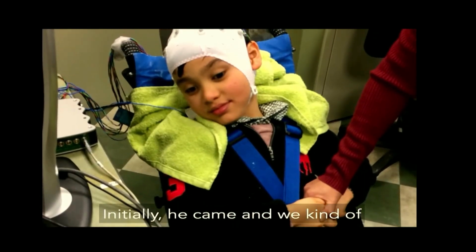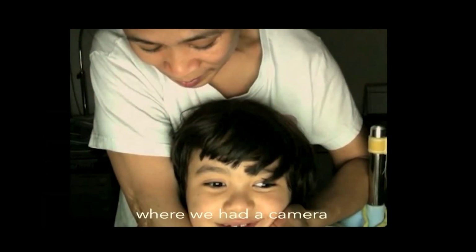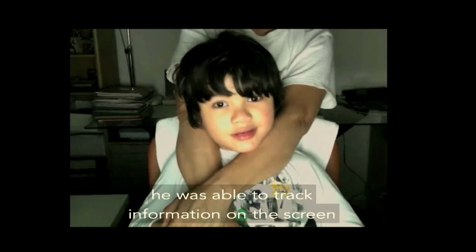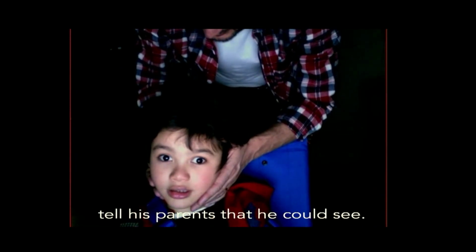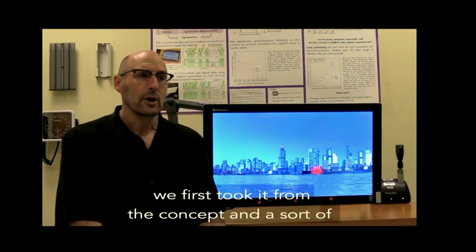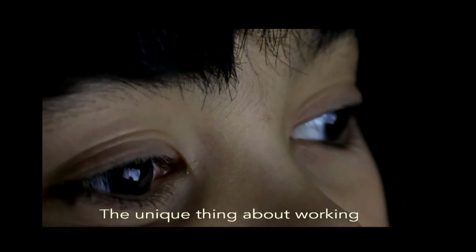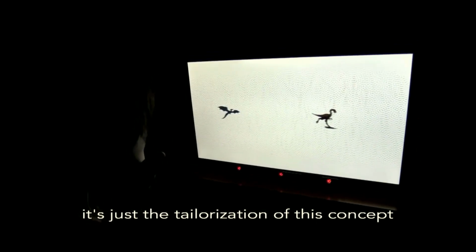Initially, he came and we did a modified version of the rodent system for Valentino, where we had a camera that watched his eyes and we placed information on the screen and moved it. And we were able to show that indeed he was able to track information on the screen and do it smoothly. And it was actually at that time the first time that we could really tell his parents that he could see. And over the course of the past 6 years, we first took it from the concept and a sort of rodent-adapted system to a specifically human system. The unique thing about working with this team is, I think, the tailorization of this concept.